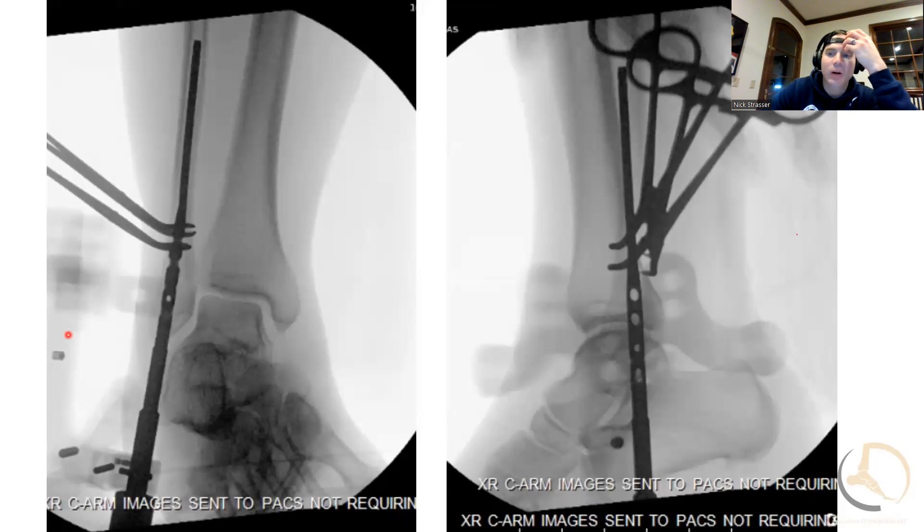One of the things I want to make sure when I'm doing these is that I know where my syndesmosis screws are going to sit and what the trajectory is going to be, because once you kind of get the nail in, you can't really adjust it that well. That's one of the things I'm always trying to double-check as I'm going through the case.